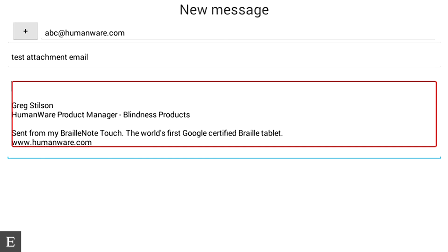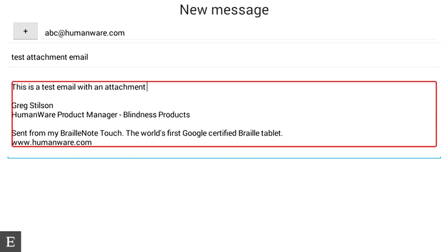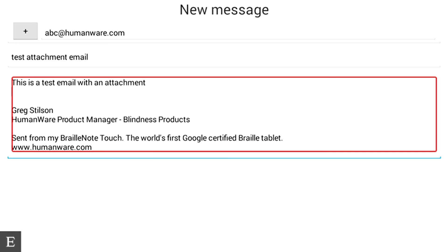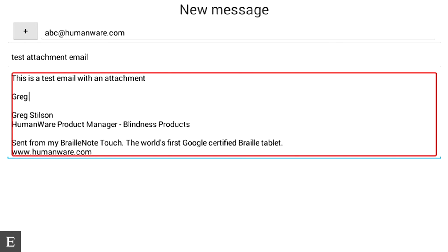I have a HumanWare signature here — it says Greg Stilson, Product Manager, Blindness Products, sent from my BrailleNote Touch, the world's first Google certified braille tablet. This signature is available on all emails I send from my Exchange account. I'm going to type in that this is a test email with an attachment, and sign it Greg.